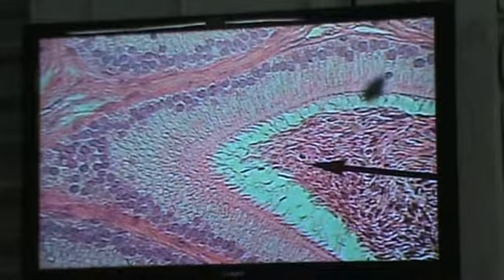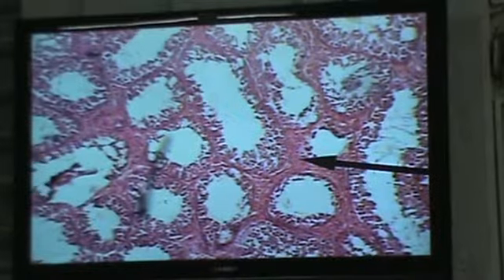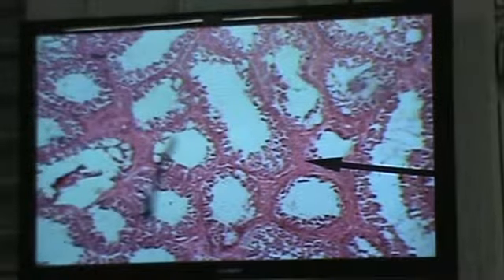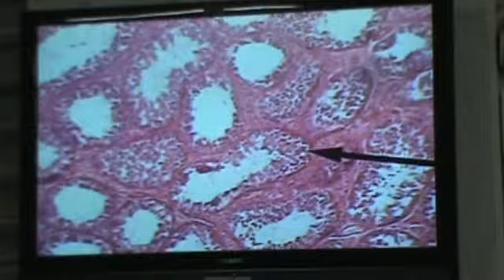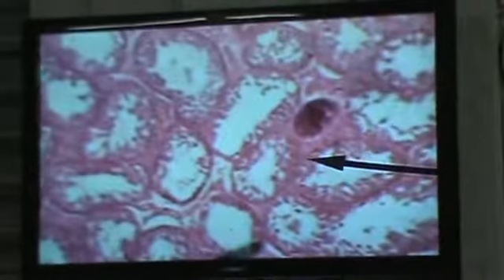Now, one last thing, and then I will take a 2 minute break. Let's look at the Leydig cells. The Leydig cells are very important. Leydig cells seem to be giving males a lot of trouble in Jamaica. Why? What do you think is the problem in Jamaica? Males in Jamaica seem to have far too much what? Testosterone. It seems to be an overload of testosterone, leading to what?